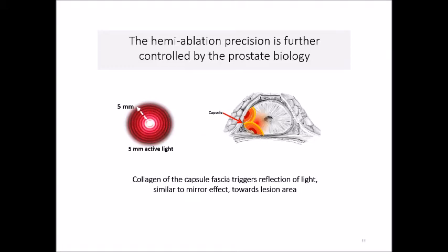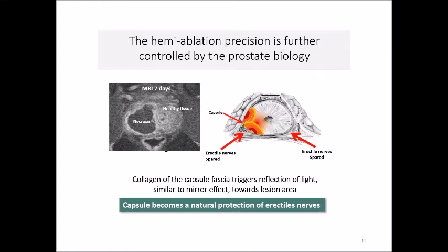Meanwhile, the mirror effect protects particularly the neurovascular bundles, which are on the other side of the mirror, and therefore preserves the erectile function.